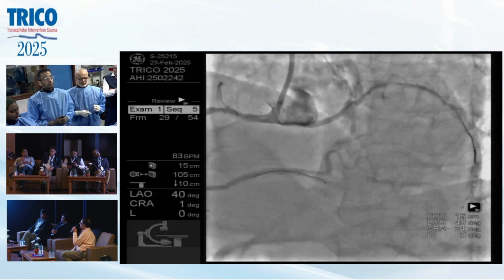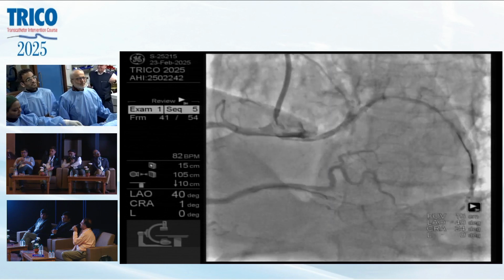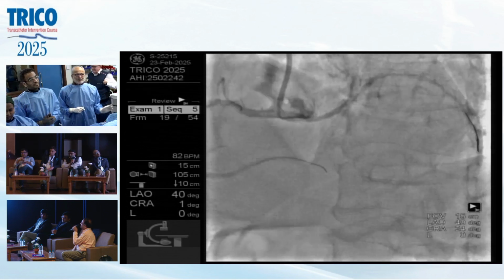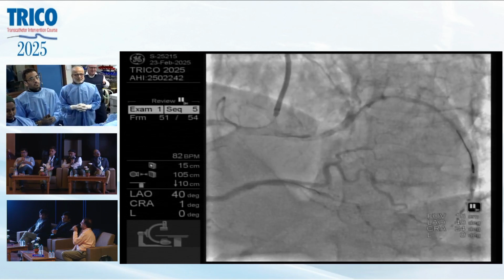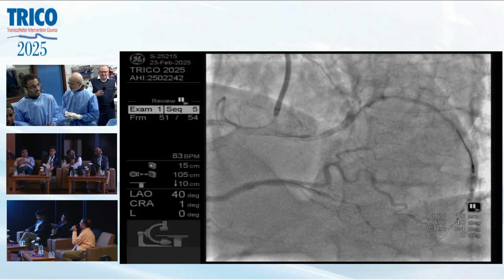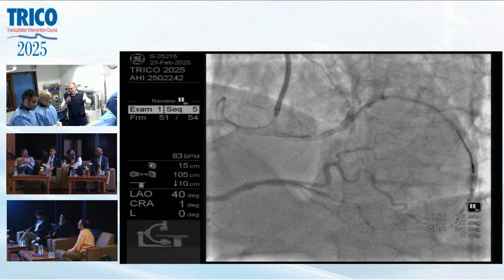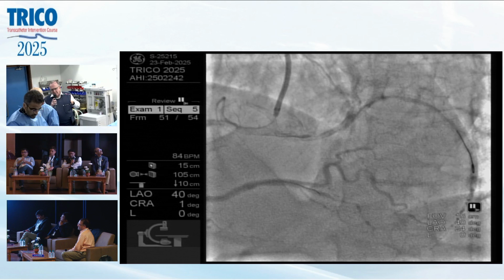It's a great point. We used to have a sign on the left ventriculogram where you see a dot on the inferior aspect of the aortic root. So just to your point, it's retroaortic and going around. It was a described sign. Malcolm probably remembers. I don't remember the sign, but I think someone on the panel does. Is Rajiv on the panel there at the moment?